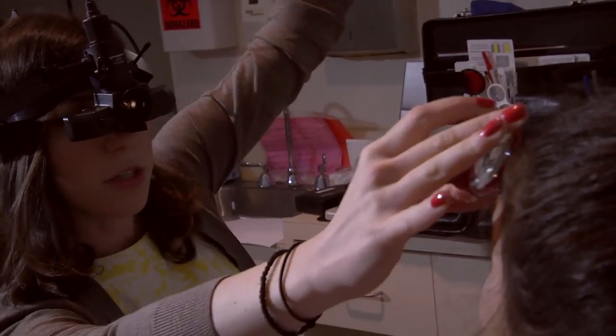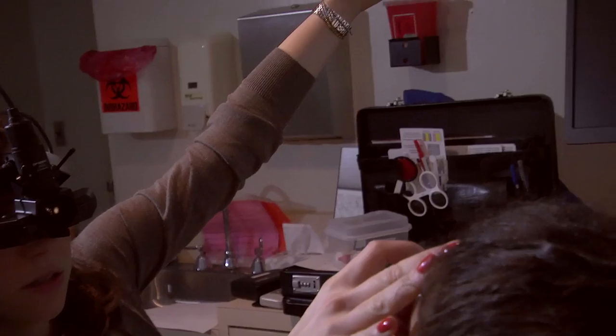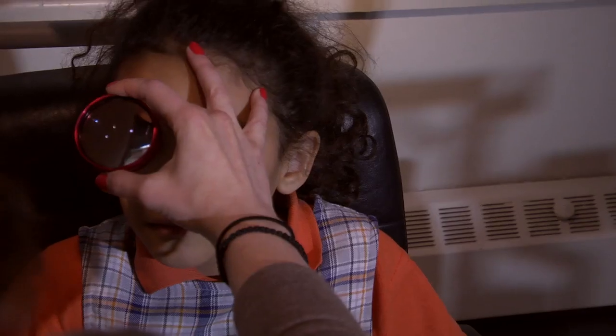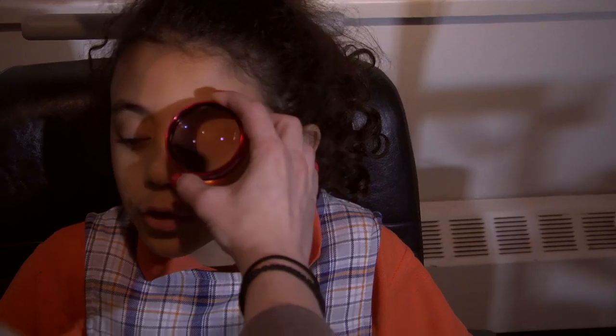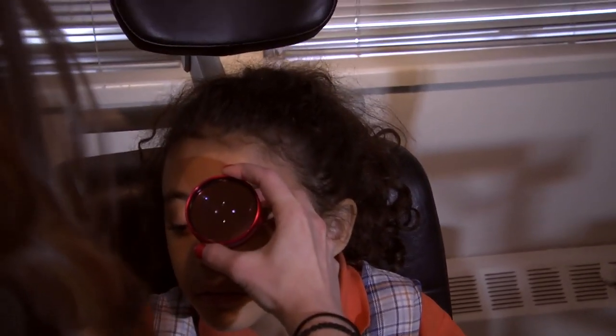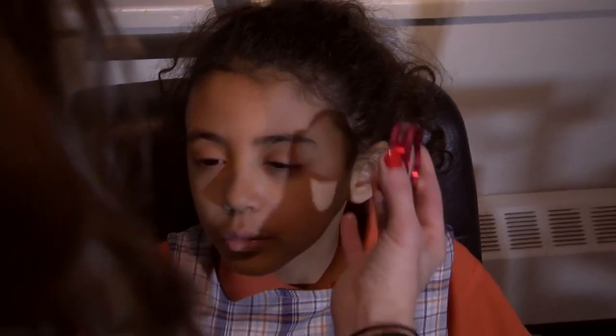Another test we do after we put the drops in is called BIO. This looks like a helmet that the doctor puts on their head and it has a light in front. With this piece of equipment, we can look at the back of the eyes. This includes the optic nerve, the blood vessels, the macula, and the rest of the neural tissue.